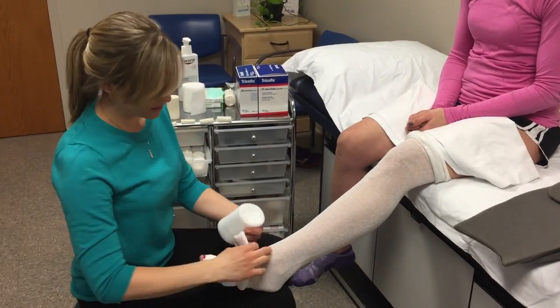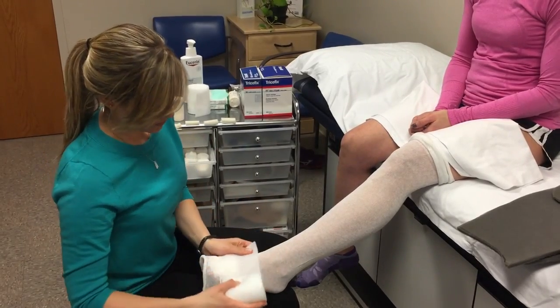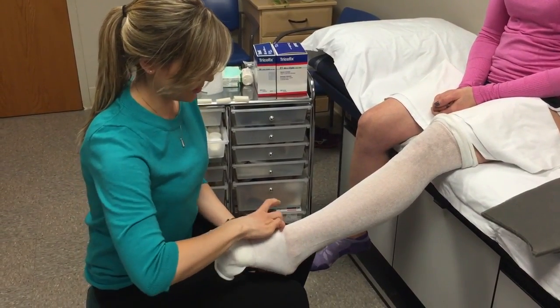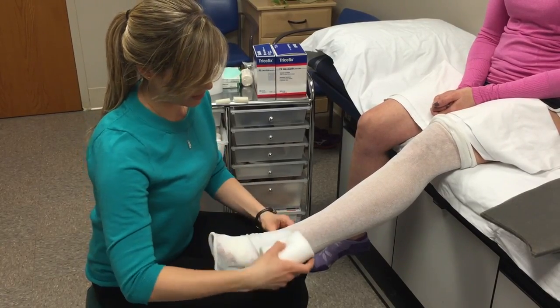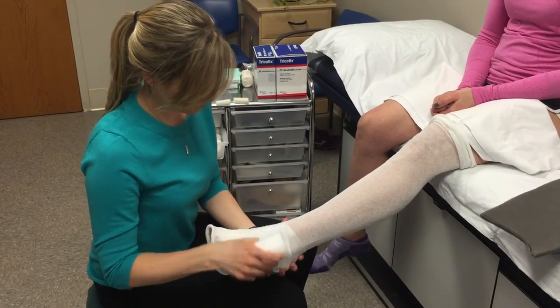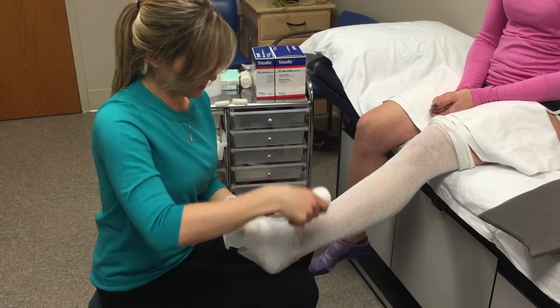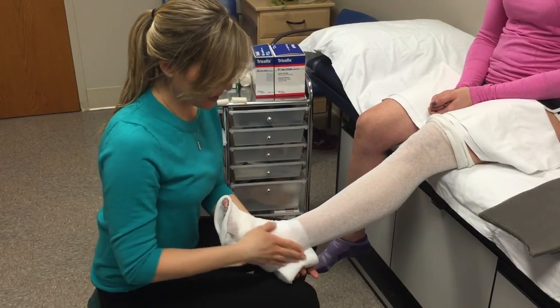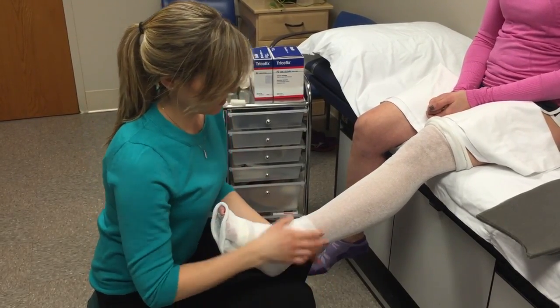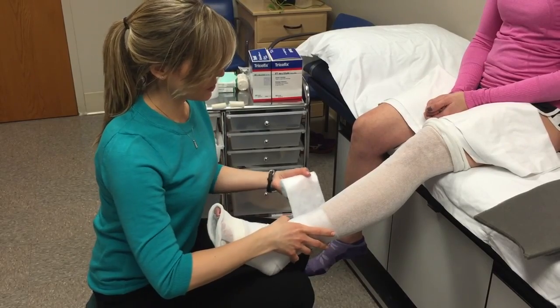Now that you've finished securing the toe bandage, go ahead and pull the stockinette down, and we're going to pad the leg with some cotton just for comfort and to make sure that we cover the bony areas of the ankle or any areas that are shaped a little bit irregularly. So you're just going to do a spiral, and you can flex your foot a little bit. Once you feel like you've padded the bony areas well enough, just spiral your way up, covering about 50% of the last layer, and keep going up to just below the knee.